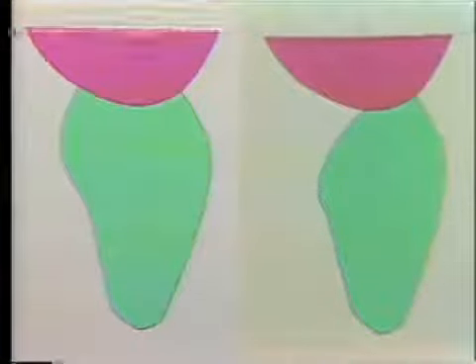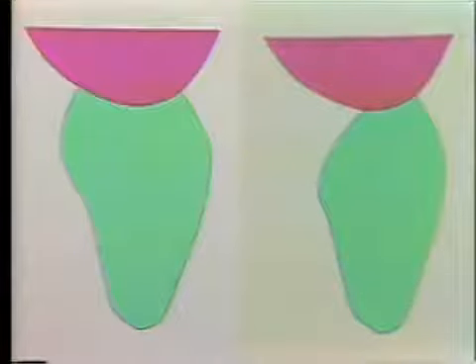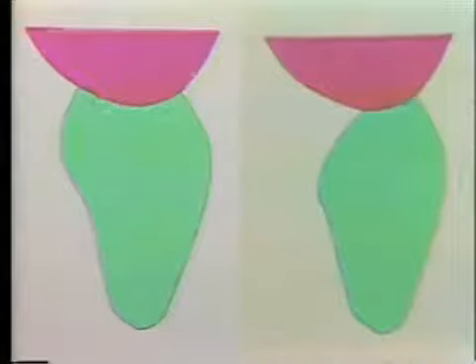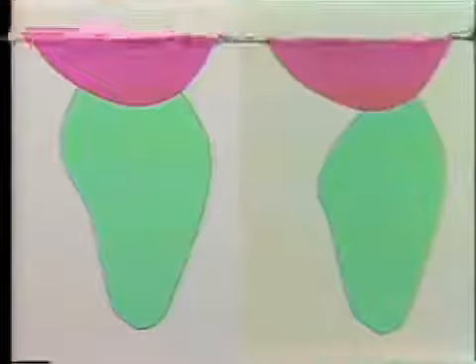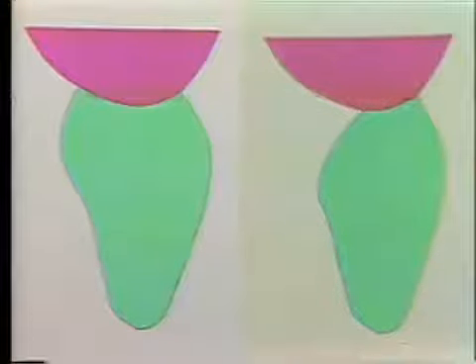In recent years, this type of Pontic has come to be used less and less, but you may come across some cases of bridges which have been done some years ago which have this type of ridge relationship, so one should be familiar with it. The one on the right-hand side, the ridge lap Pontic, is the one normally used in the anterior situation in bridges these days.